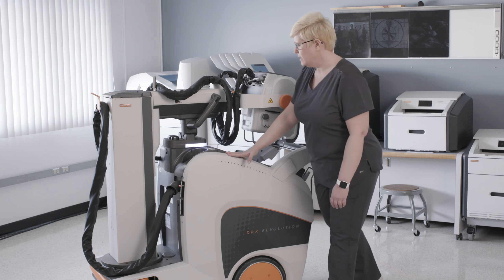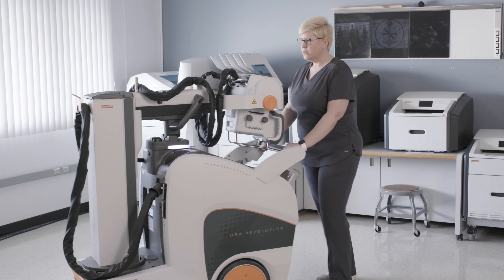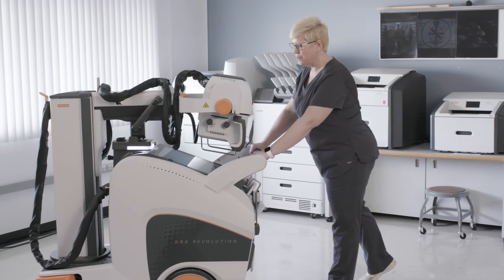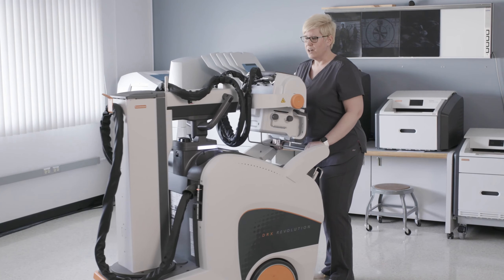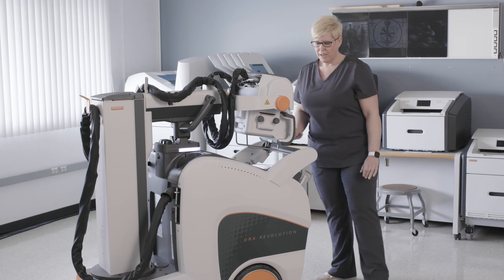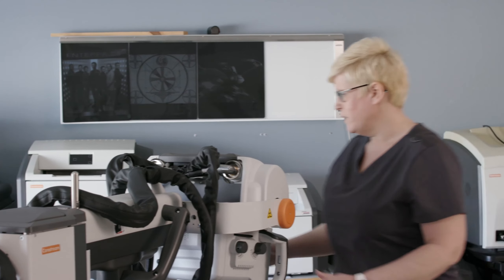So with the redesign of the cart, the engineers have dampened the motors, making the sound of this cart driving in and out of patient rooms pretty much inaudible. They have also added a collapsible quiet cap on the collapsible column that eliminates the sound of the clicking that you would normally hear when the column is moving up and down.